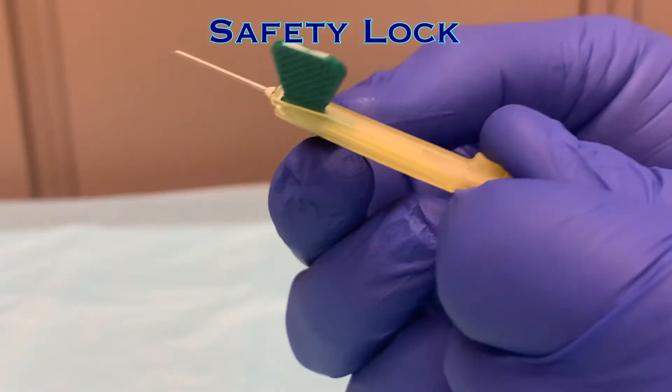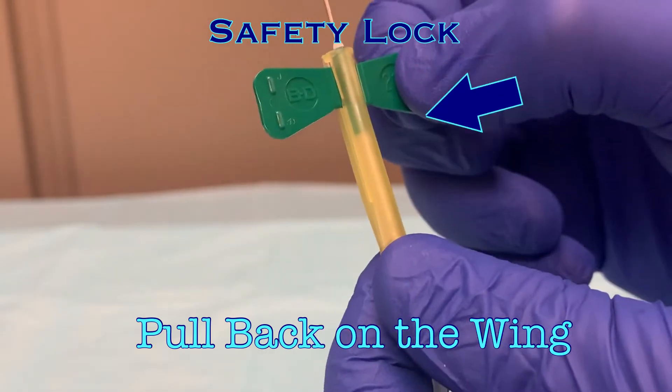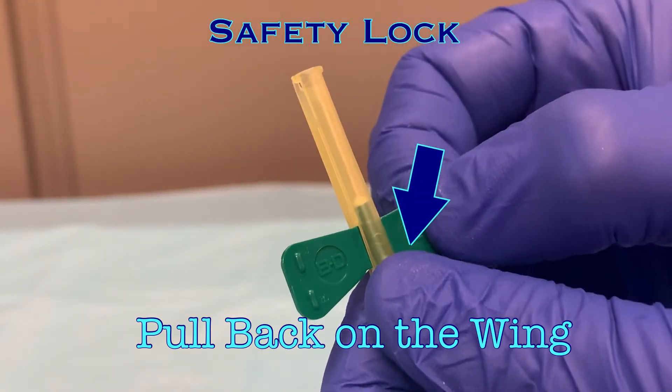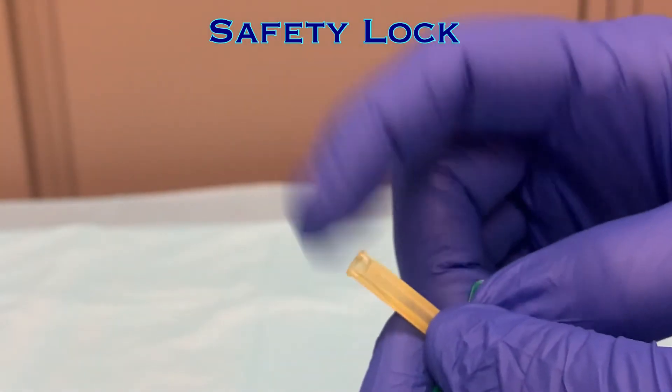The butterfly needle also has a safety lock feature to protect from accidental needle sticks. To engage the lock, secure the yellow hub with one hand. With the other hand, gently pull back on the wing. The yellow hub will slide over the needle, and when it is fully retracted, a lock will engage and the needle will be permanently protected within the hub.